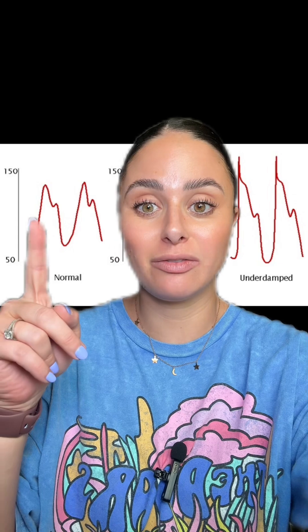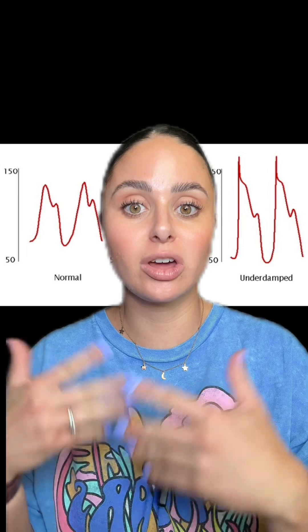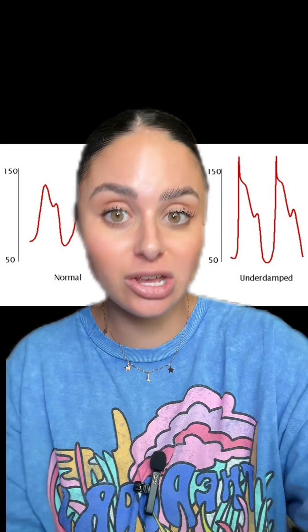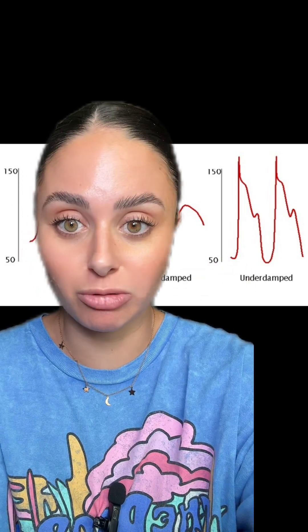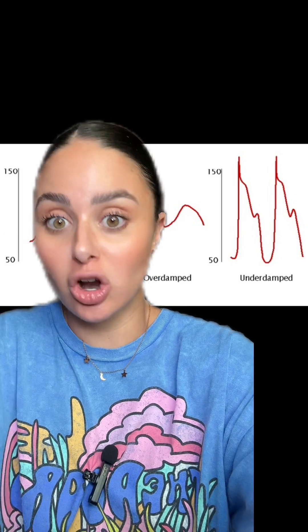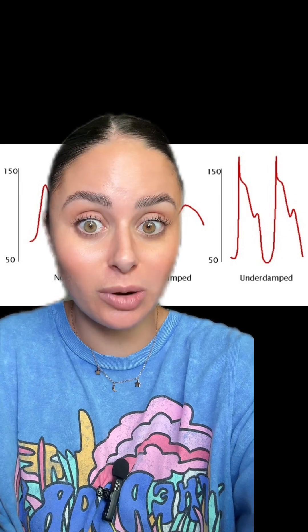It's super important to be able to identify a normal arterial line waveform in order to ensure that our arterial line is reading accurately. An A-line that is over damped or under damped is not going to give you an accurate reading, therefore you are not going to be accurately charting, documenting, or titrating medications off of that patient's blood pressure.